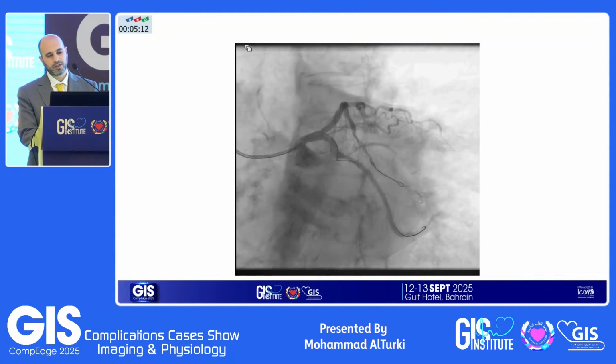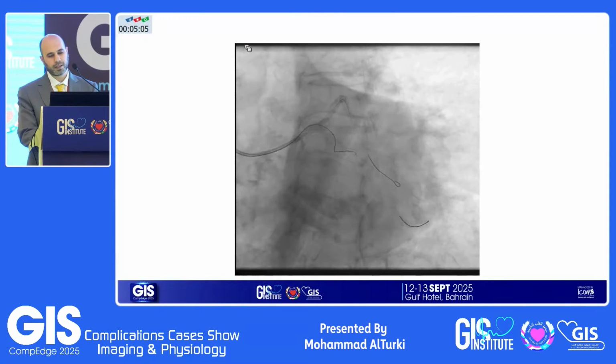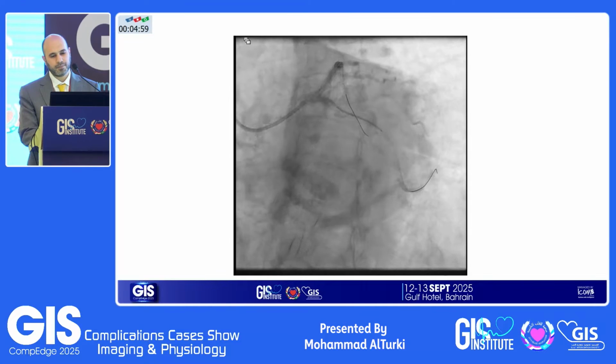I don't have images of this, but I performed IVUS, which confirmed I went true lumen, false lumen, and back into the true lumen. So I was happy ballooning and stenting at this stage.